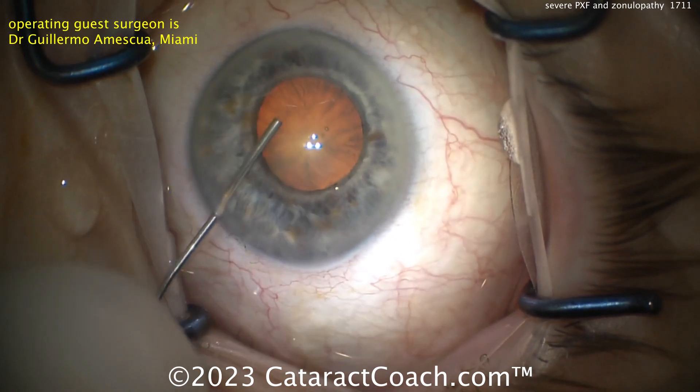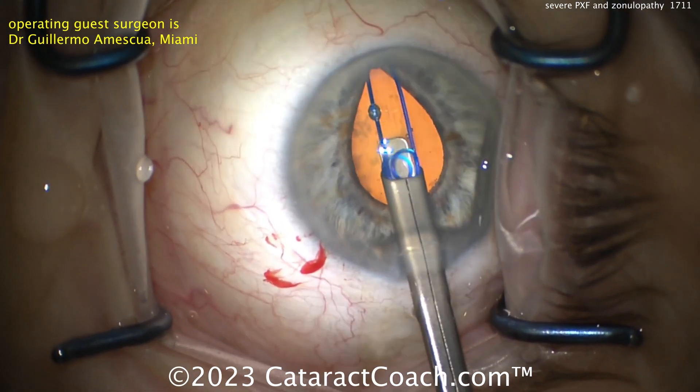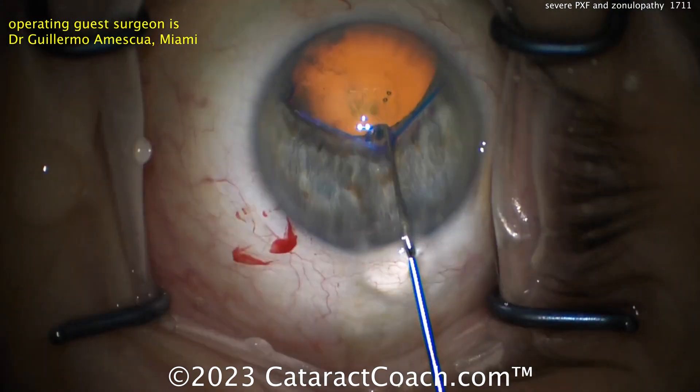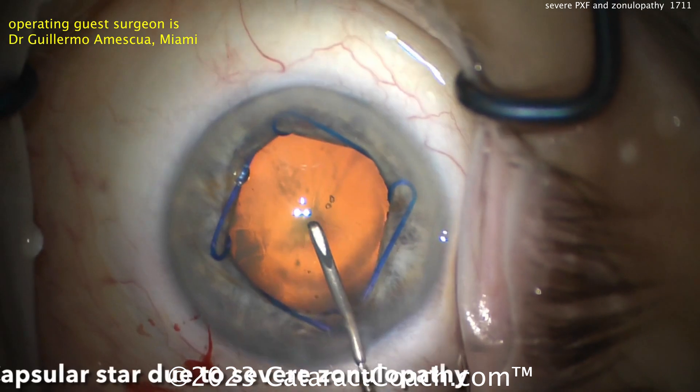Here comes the viscoelastic. Don't overfill. Now a Malugan ring going in — be careful inserting this. I like to put a chopper through the side port so you can put that last ring on all at once. Get that centered up.